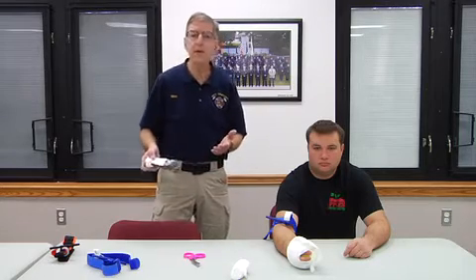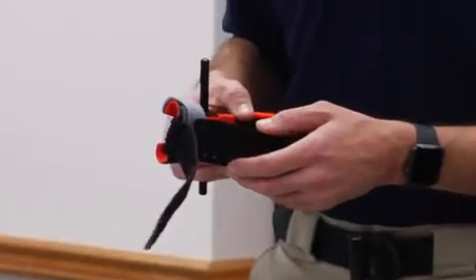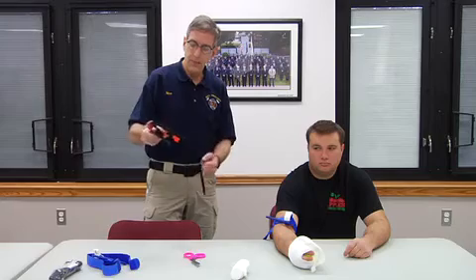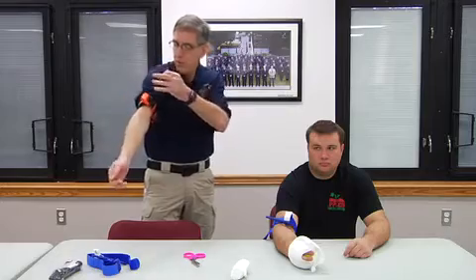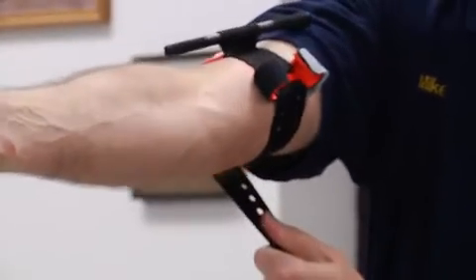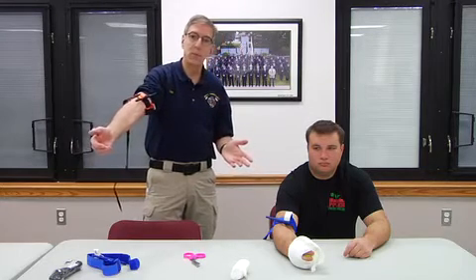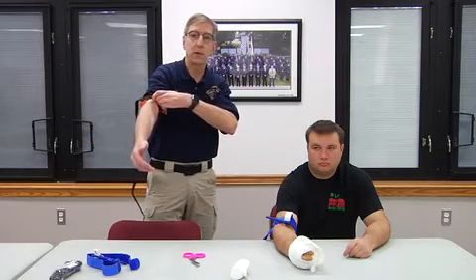I mentioned that there are some changes in tourniquets, and one of the newest tourniquets that we're looking at currently, and the military is studying, comes to us from our friends that make the SAM splint. To apply it, it has a ratcheting system, so when you put it onto the extremity and pull on the tourniquet, initially you'll hear a clicking noise. That tourniquet locks in place in the position that it initially was applied, which alleviates some of the issue with our earlier tourniquets, where they loosen a little bit before you're actually able to tighten the windlass.